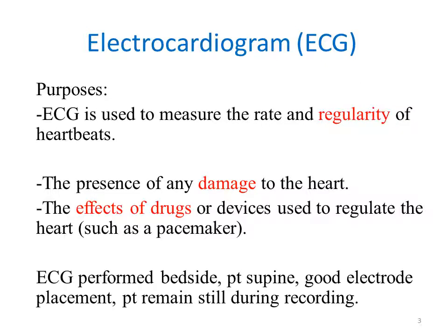The purposes of doing the electrocardiogram. ECG is used to measure the rate and the regularity of the heartbeat, عدد دقات القلب, and to indicate if the rhythm of the heart beating is regular or not, that the heart has a regular rhythm or irregular rhythm.